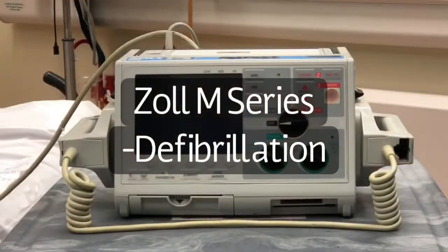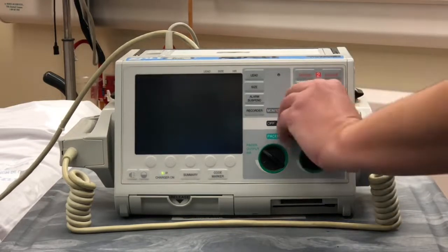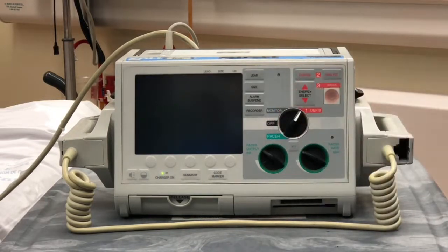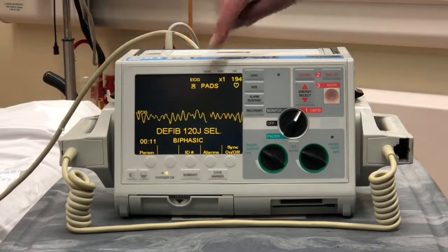When we're using the Zoll M series in a cardiac arrest situation, once we've applied the pads, we want to turn the device on, read the rhythm, and assess if we need to deliver a shock. We can turn the dial right on to defib, and we notice that on the screen the device is reading from the pads which are on the patient.